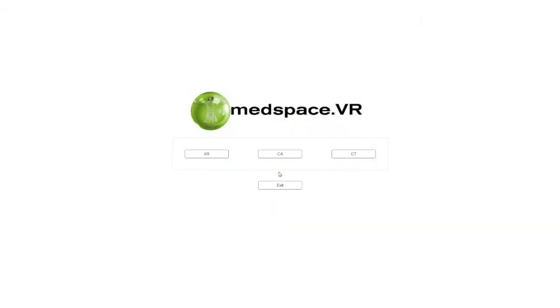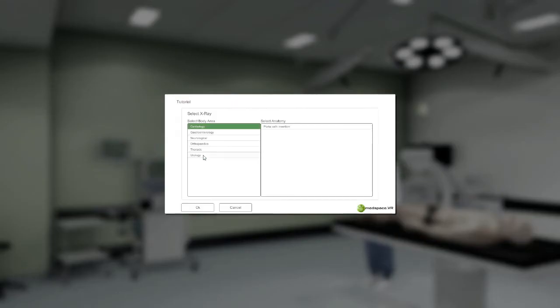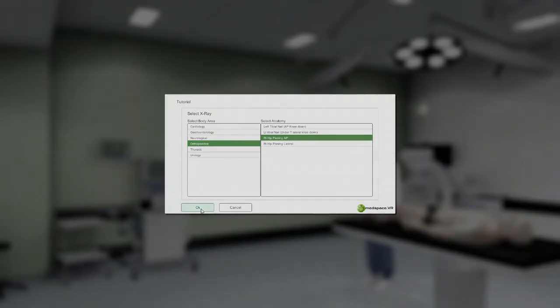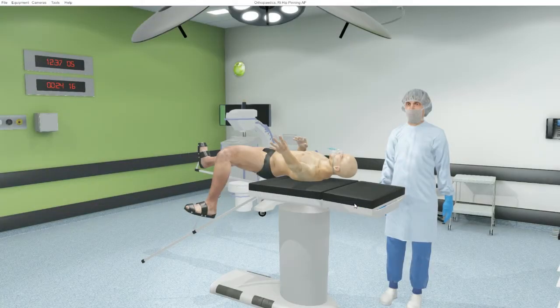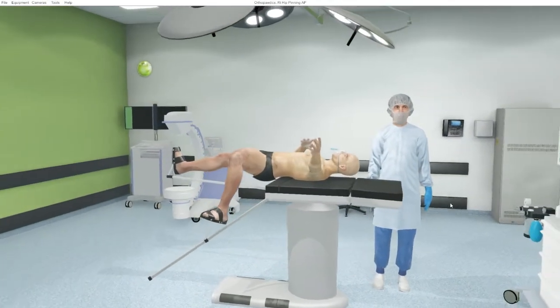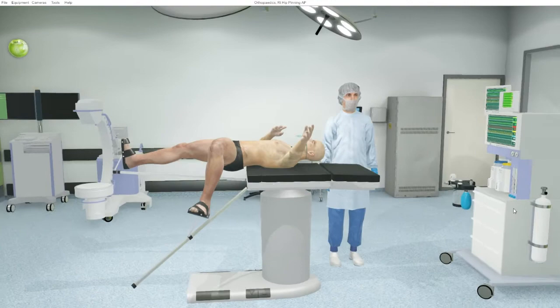Unlike other MedSpace VR modules, users have no control over the initial environment or the patient position, which mimics clinical practice. The user will start by selecting a protocol and this will immediately place them into the operating theatre with the patient positioned as per surgical procedure requirements.